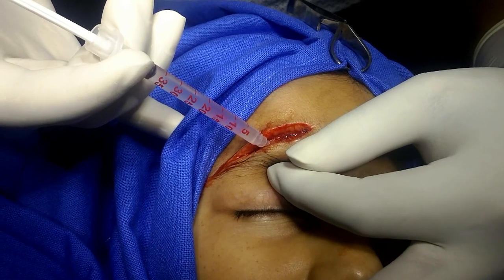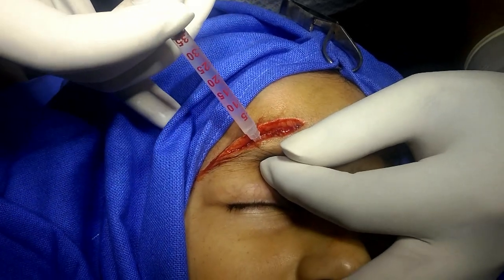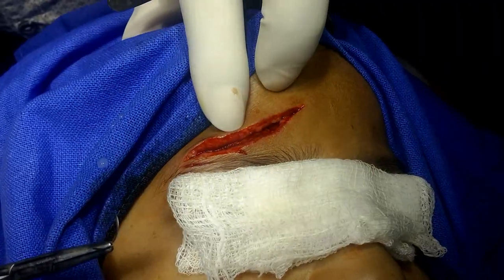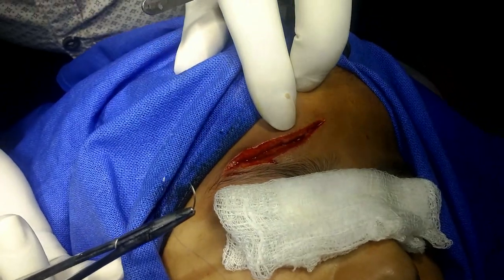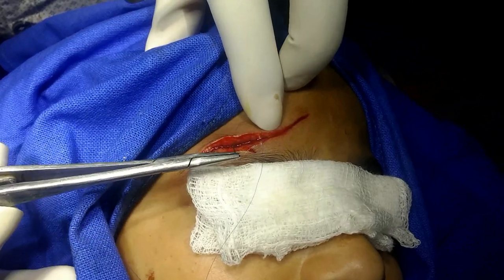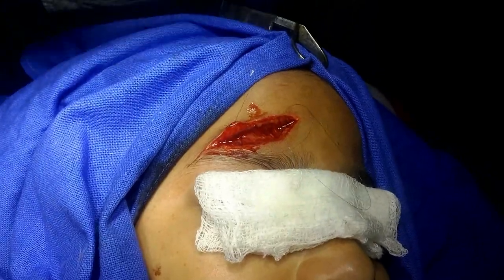At this site, I insert the needle and move the tip slightly to avoid accidental intravascular injection, because this nerve is associated with the supraorbital vessels. Now aligning everything carefully and matching the tissue — this is six-zero polypropylene suture.